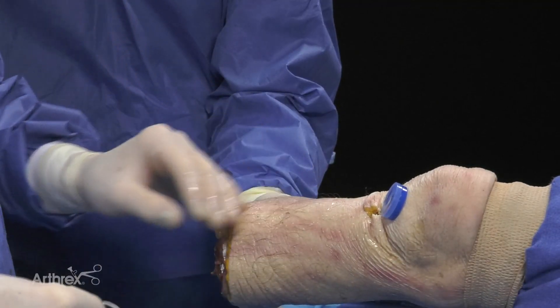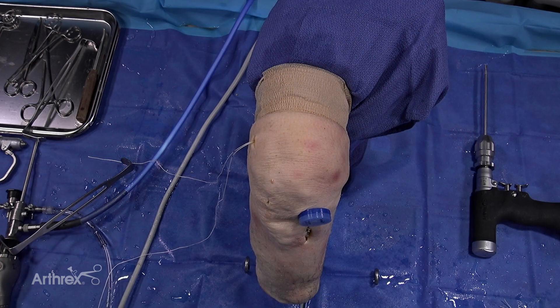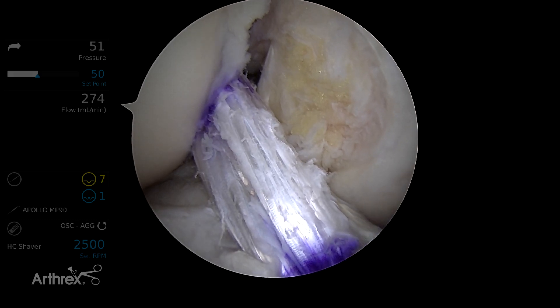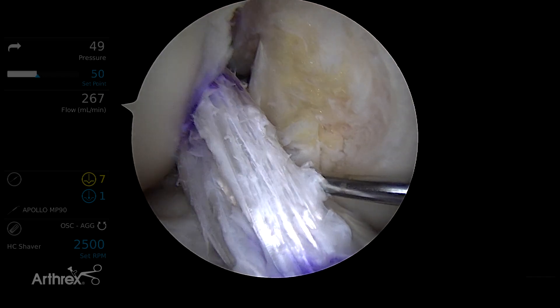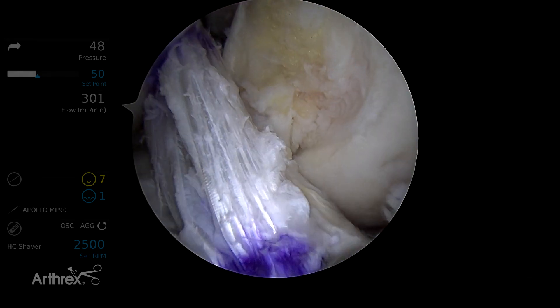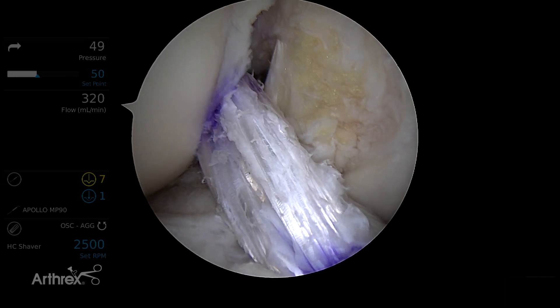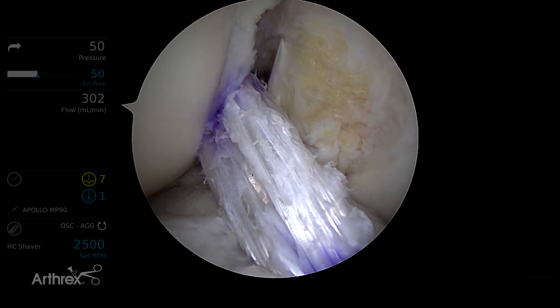So that's the completed all-inside technique with the independent internal brace — let's take a look at our graft. Here's our final construct and you can see the quadrupled semitendinosus. Notice you don't see the tapes for the internal brace — the way I showed you the graft preparation, the tapes are inside. Great tension on this graft. AM bundle attachment at the femur, tibia isometric, tapes in place, very secure, good position of the graft. Remember I only use the semitendinosus, so I preserve the gracilis — another advantage of this all-inside technique. You just need the semi-T only to quadruple.